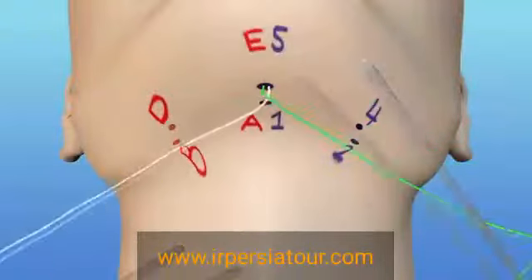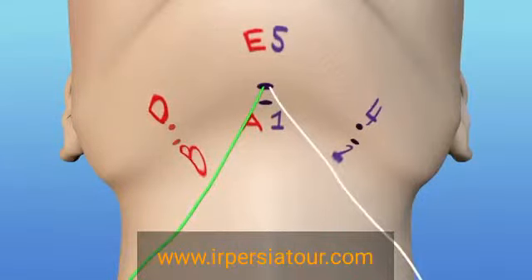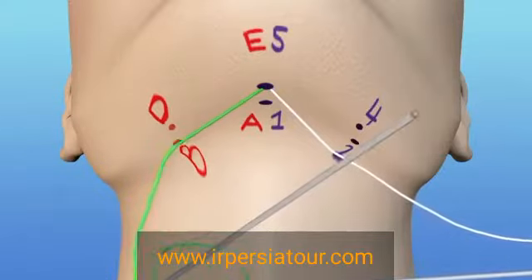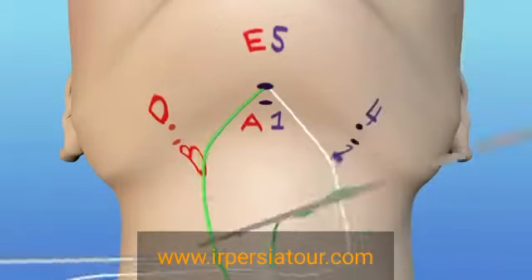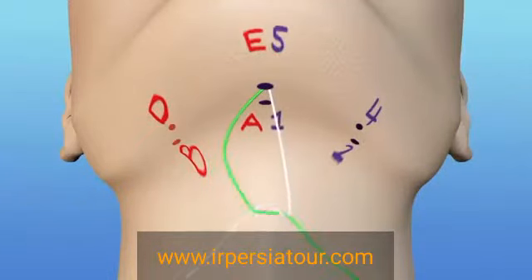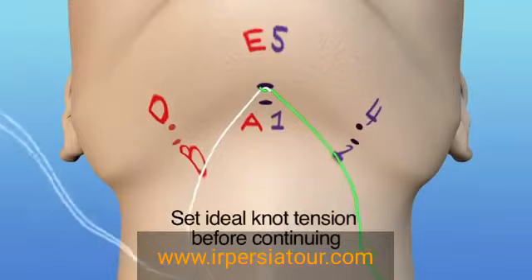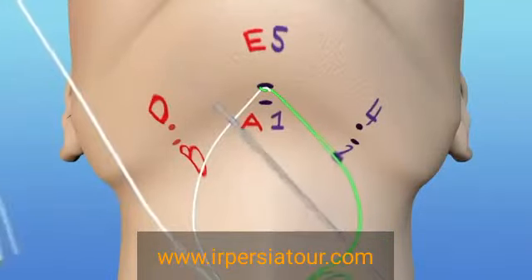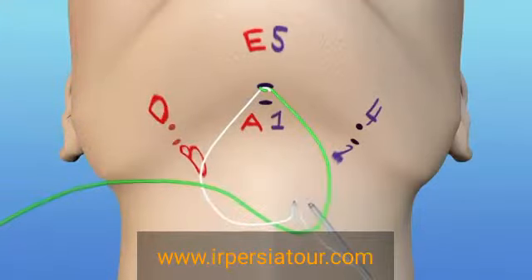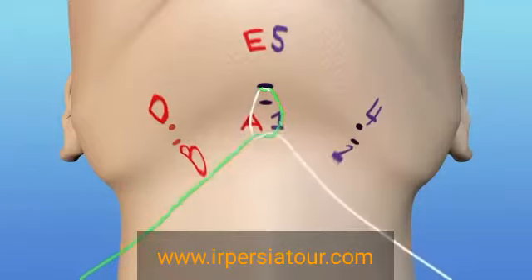So once again in review, you throw the first throw, which will set the tension. You observe the neck and look for the point where there's just visible tensioning of the skin with the patient's neck extended. Once you've established the correct amount of tension, then you can go ahead and lock the knot by placing another throw. The first throw can either be a surgeon's knot double throw or just a single throw in a square knot, as in this application that you're seeing right now.